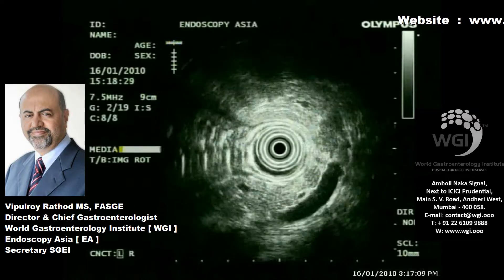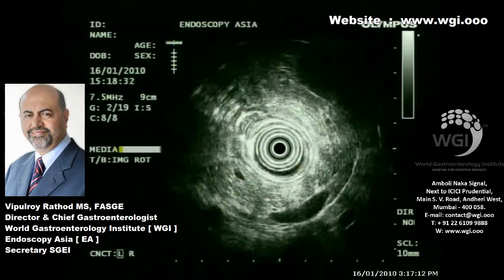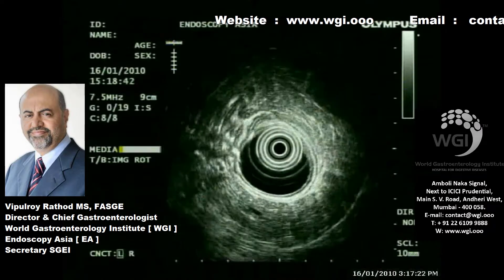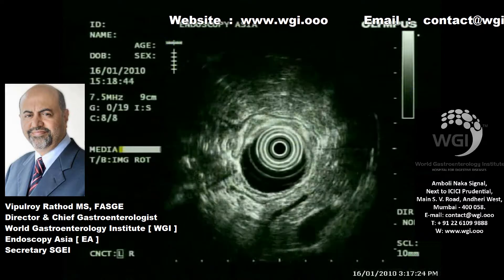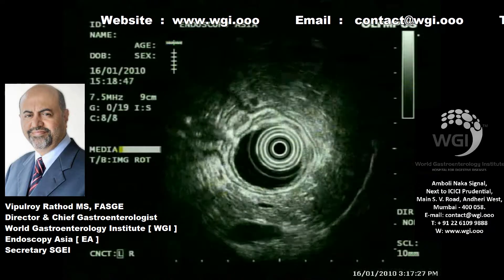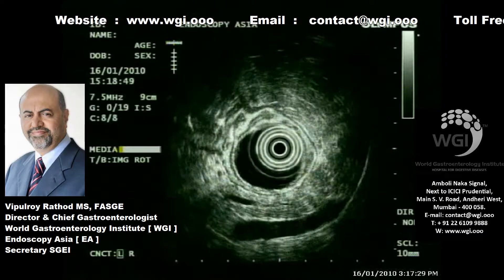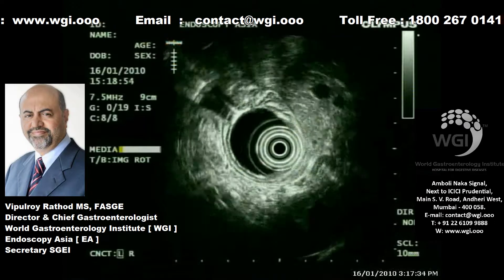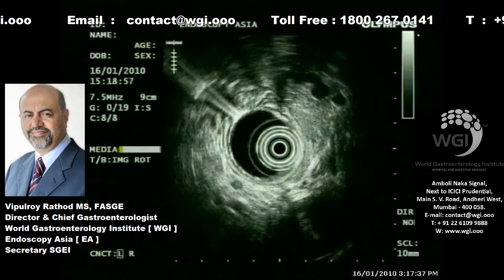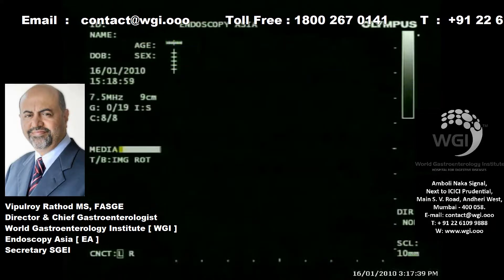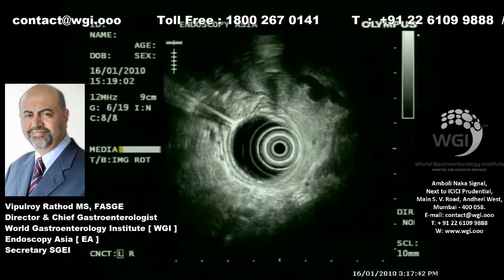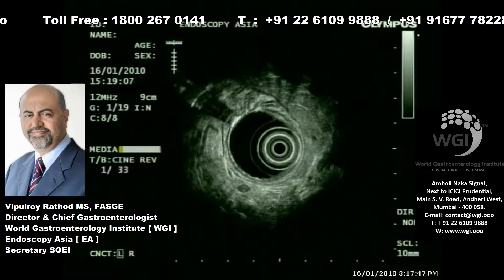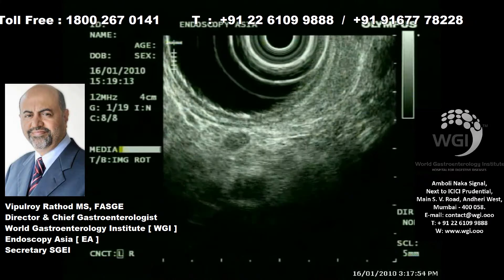You can see the mildly prominent pancreatic duct in the body of the pancreas. We evaluate any pancreaticobiliary tumor for celiac axis lymph nodes as a standard protocol. We need to see the celiac artery area. You can see small, round, sub-centimeter hypoechoic nodes. People can debate whether these are reactive nodes secondary to cholangitis, or definitive metastatic nodes.